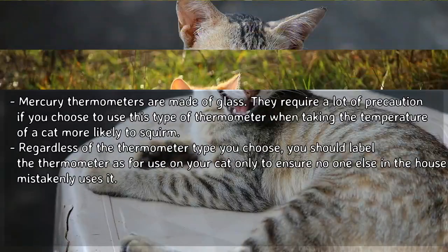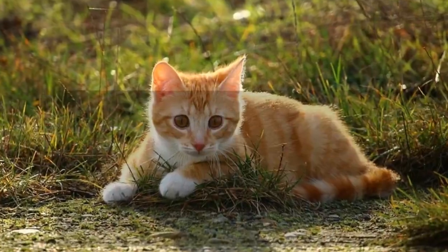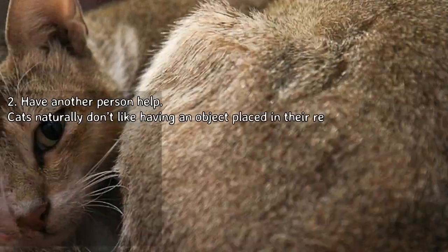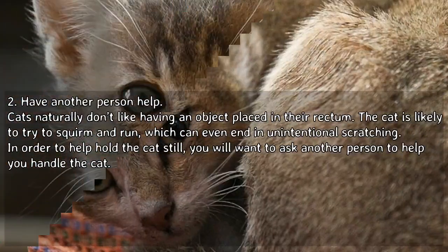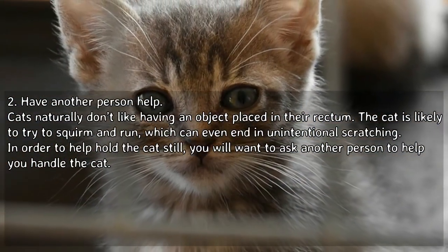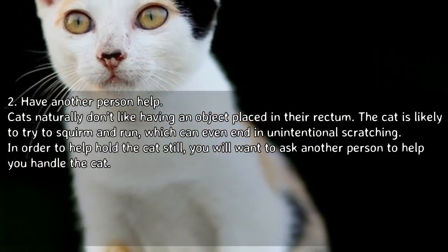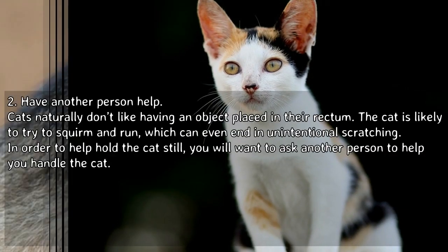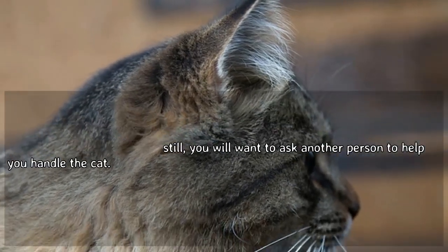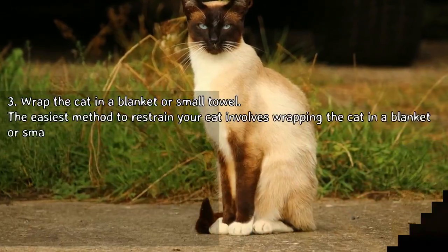Regardless of the thermometer type you choose, label it as for use on your cat only to ensure no one else in the house mistakenly uses it. Have another person help, as cats naturally don't like having an object placed in their rectum. The cat is likely to squirm and run, which can result in unintentional scratching. Ask another person to help you handle the cat.